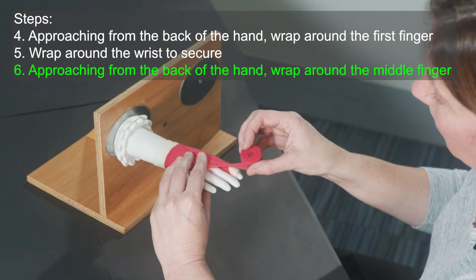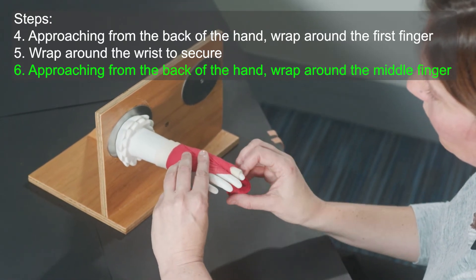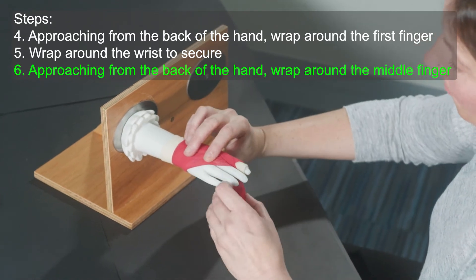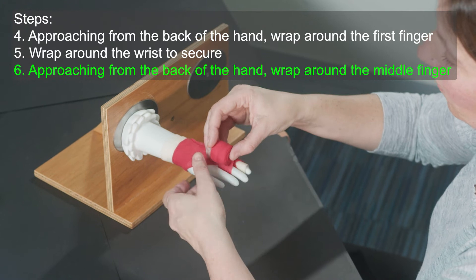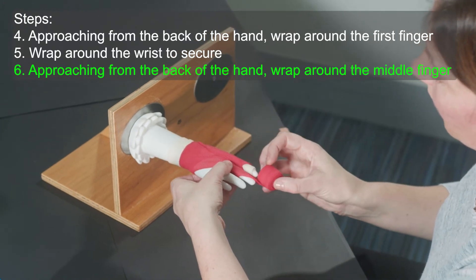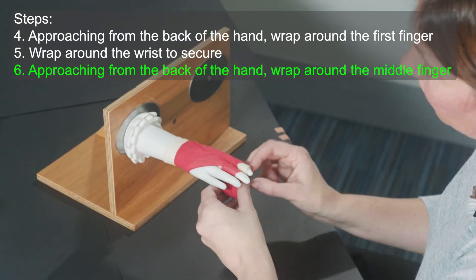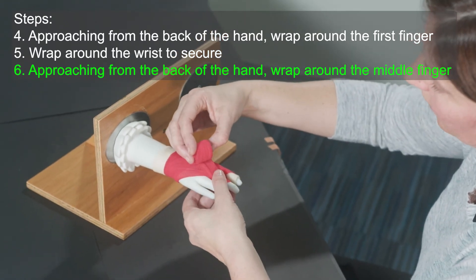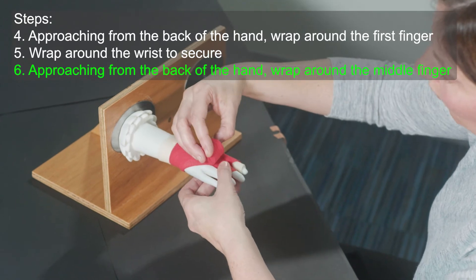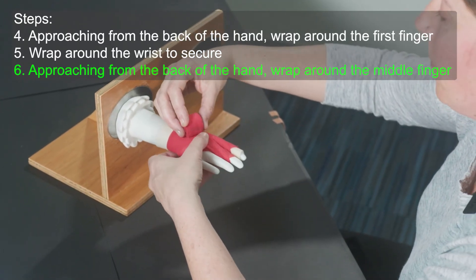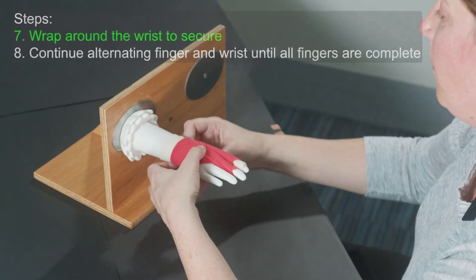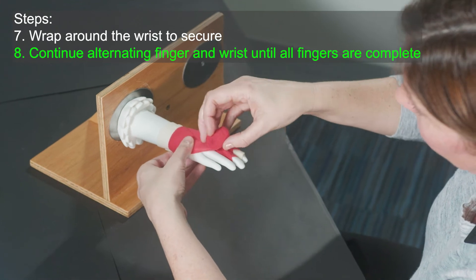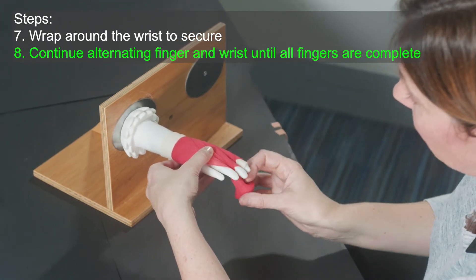You're just going to go around the wrist and we're going to go straight up to doing the middle finger. You're going to bring your wrap again, just holding it at the back of the hand so you're not putting too much tension on the bandage as you're bringing it through the web space. One of the things that's nice about wrapping each finger is that we can use the gentle stretch in the bandage to try and help open the fingers and keep them as straight as possible.